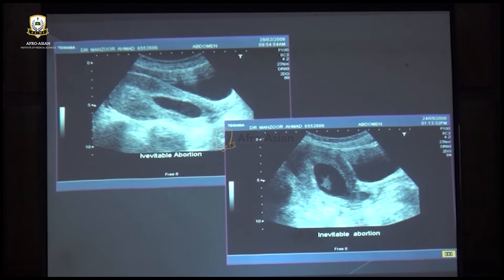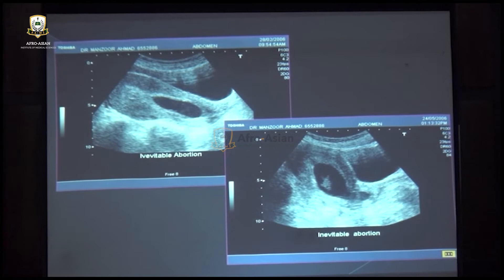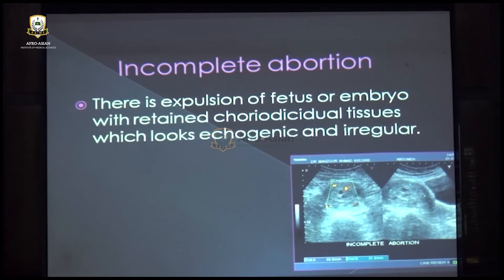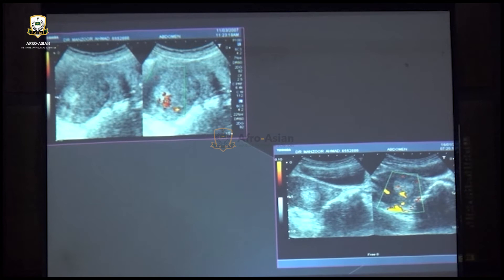You can see incompetency of the internal os of the cervix with pregnancy present — this is abortion in progress or inevitable abortion. Sometimes there is a history of pain and bleeding, and we see residual echogenic tissue within the uterine body — that is a retained product of conception, which is incomplete abortion. The echogenic substance within the uterine body may show flow or absent flow on Doppler.